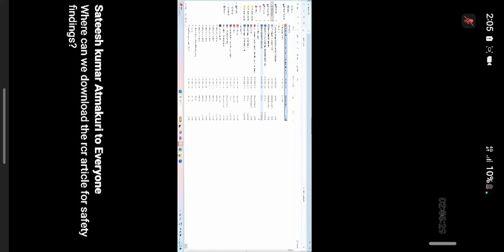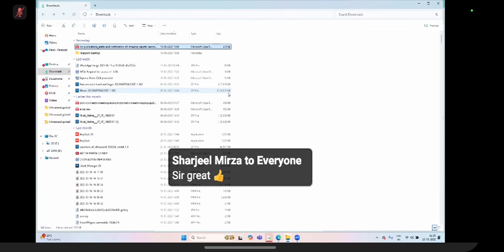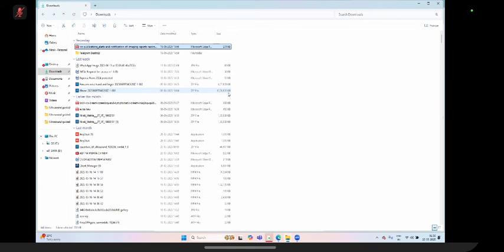We are going with different cases every time so that you will be familiar with all kinds of different aspects. And as I told you, what to speak is very important. Just speak the observations which are relevant to the clinical context. Don't speak all the observations. The rest of the observations, if important, like gallstones in the case of intestinal ischemia, or in the case of hernia obstruction, you can say in the end, as the candidate also said it in the end. But the main clinical context was obstruction. The clinical question was obstruction. You have to answer that first. You have to answer the clinician's clinical question.